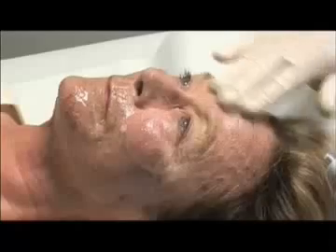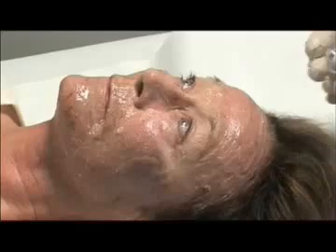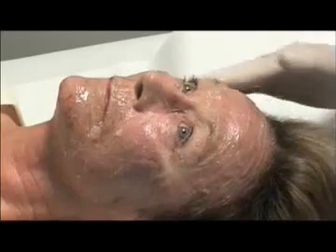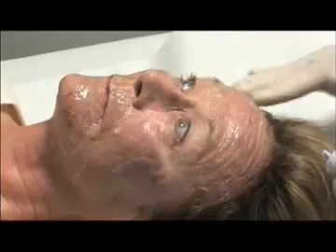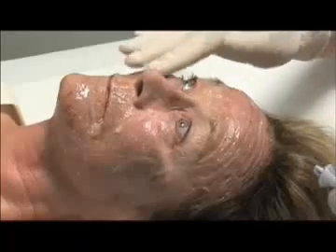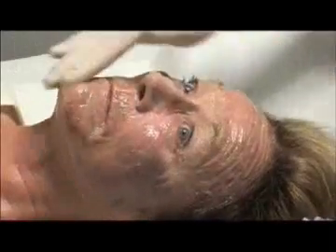That means that it's not only important to successfully perform the intervention, which seems to be the case here, but we must also make sure that the healing process is successful. The second stage is as important as the first. This is fundamental. We will then ask the patient to wash her face under the shower morning and night using a foaming antiseptic soap, and once it is rinsed, to apply an oil-based flucidic acid cream to avoid infection.